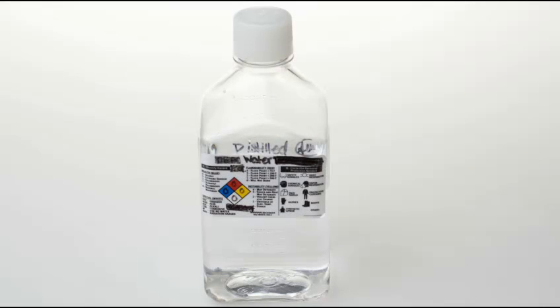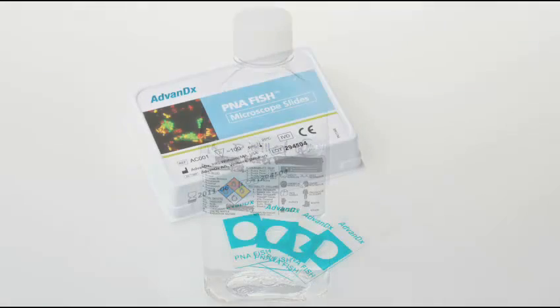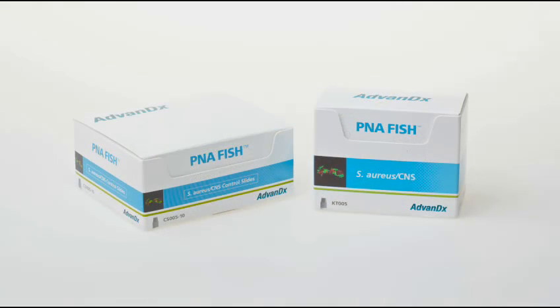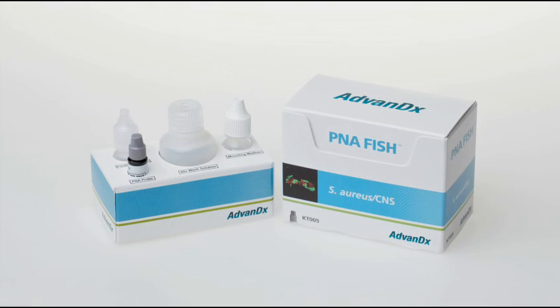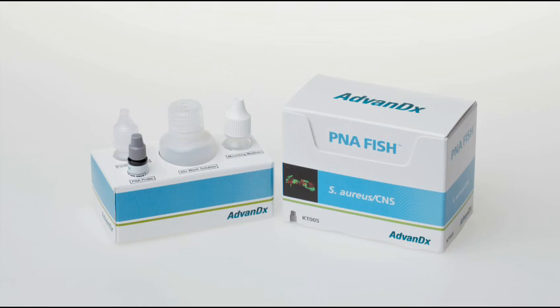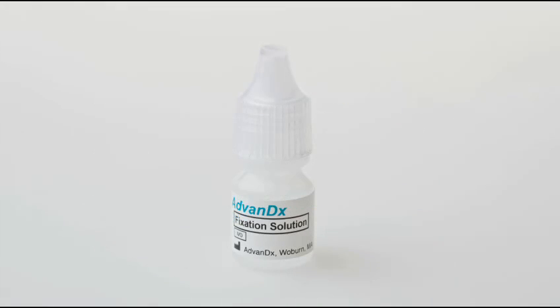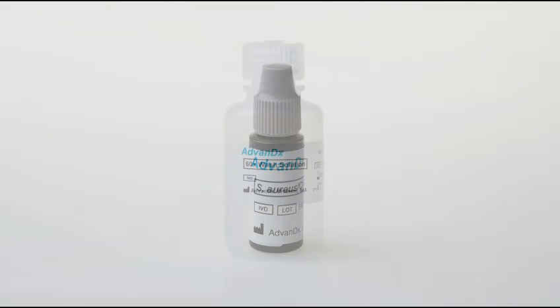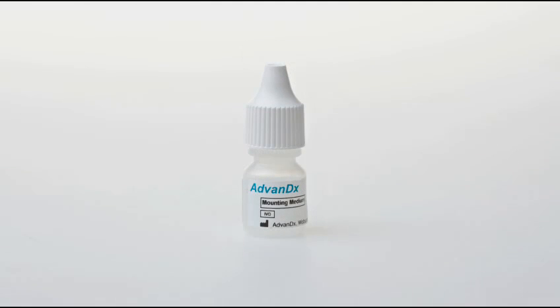Deionized or distilled water, PNA FISH microscope slides, cover slips, and a PNA FISH kit with corresponding control slides. Each kit has enough reagents for 50 tests and includes a bottle of fixation solution, a bottle of PNA probe, a bottle of 60x concentrated wash solution, and a bottle of mounting medium.